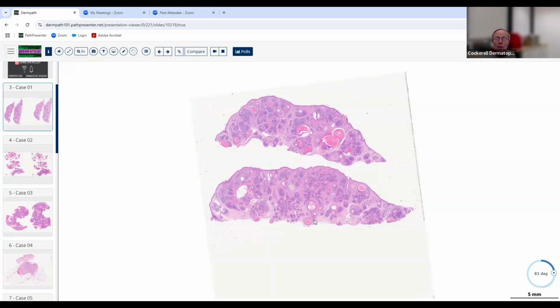The next question is whether we think it's benign or malignant, and we use our typical criteria. Is it broad, asymmetrical, poorly circumscribed? Those are low magnification architectural features of malignancy. This thing looks relatively small. We took a shave and probably got 90% of it out.